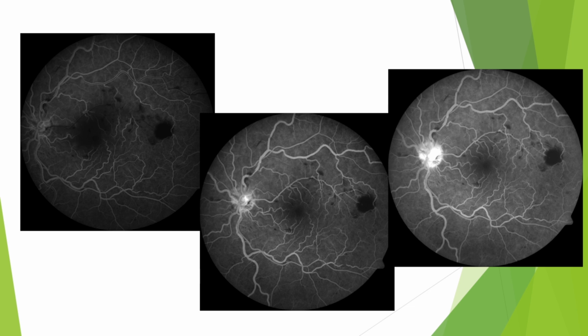The first image. Okay. In the first image we can see the laminar flow in the vessels. I'm asking about that image. Yeah. What else do you see?